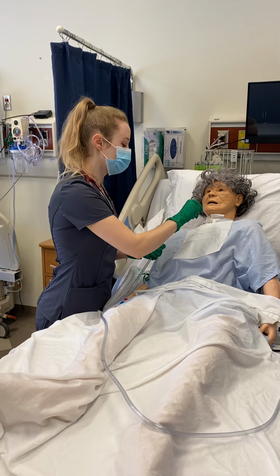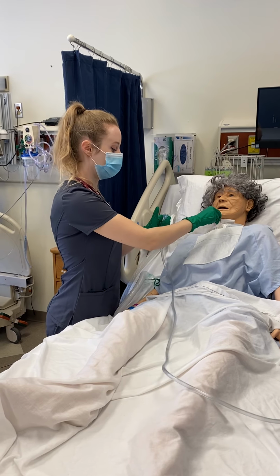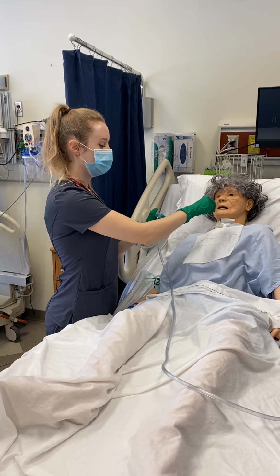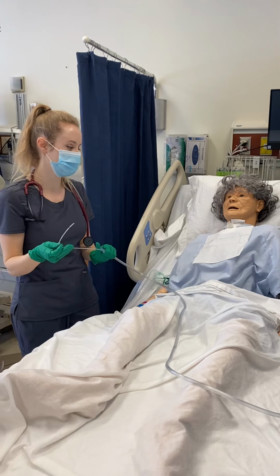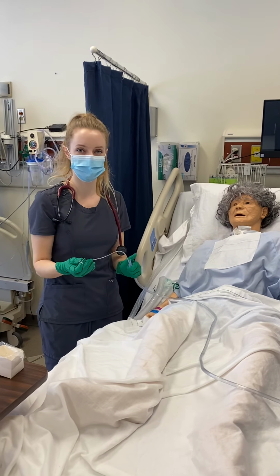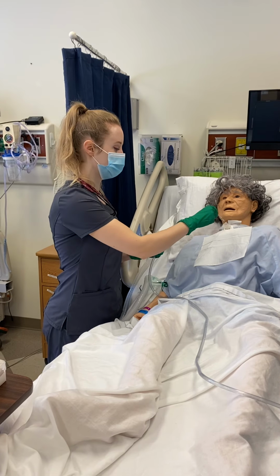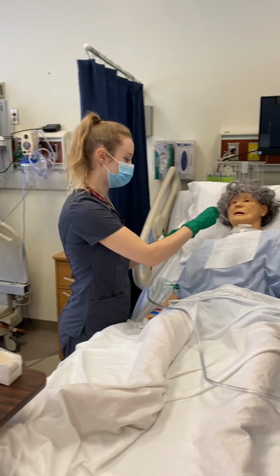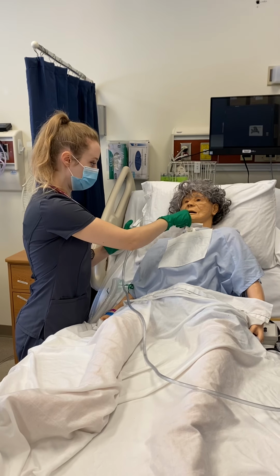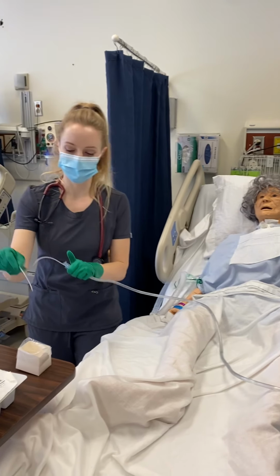I will insert until I meet resistance, and then applying pressure intermittently, I will suction for about 10 seconds. If possible, I will let my patient rest for about 2 to 3 minutes in between suction passes, and I suction until I have removed all the secretions, suctioning some saline to clear in between, and checking on my patient and then watching their oxygen saturation and watching them for any signs of distress.